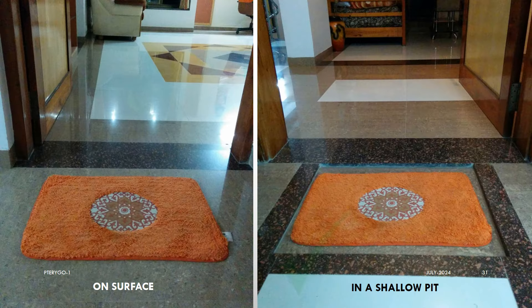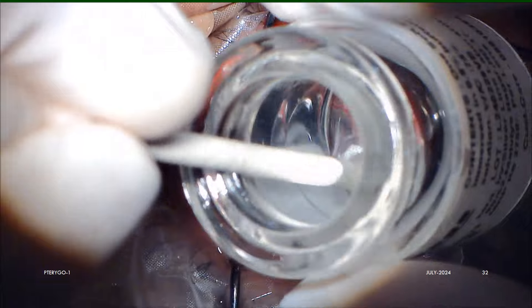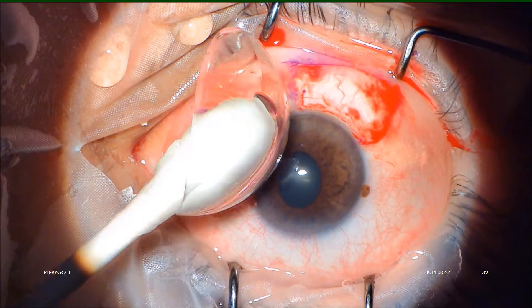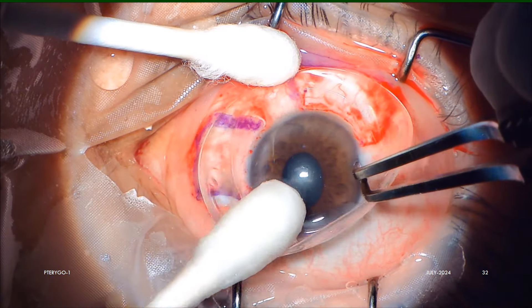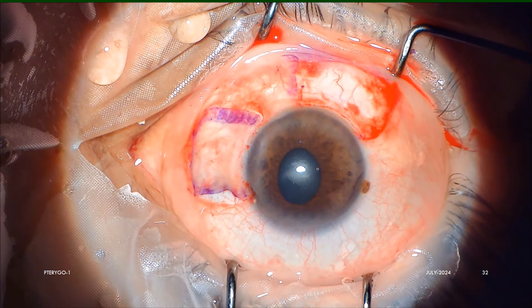The flap is in situ like in a shallow pit, so it will usually stay there fairly well. With a wet cotton swab, we take out the Pterygo BCL from its bottle, which is then invertedly spread over the cornea and graft flap. It is like spreading a king-size big bed sheet, so we will need at least three or four hands to spread it, and the scrubbed assistant has to help the surgeon in this step.